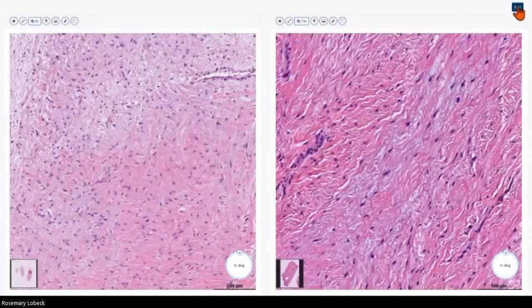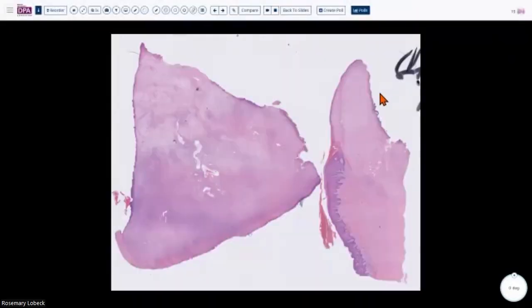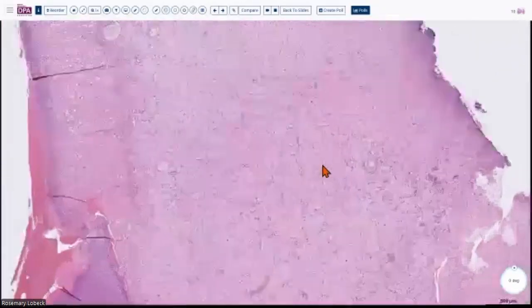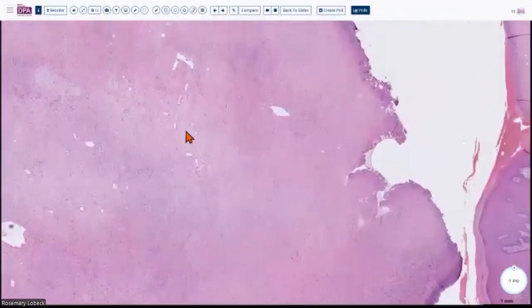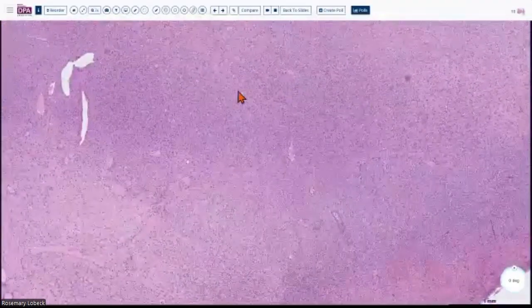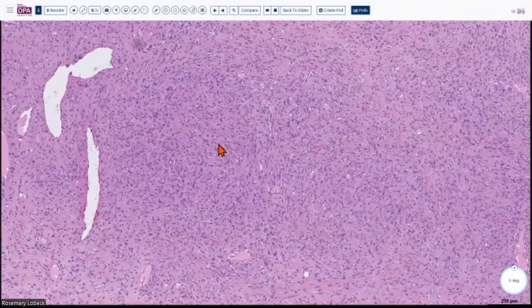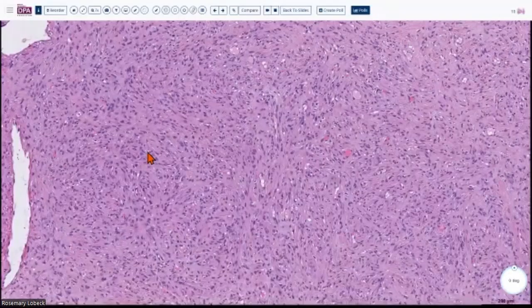So I will show you a little bit more of this later on, but right now I want to show you a couple of other things that low-grade fibromyxoid sarcoma can do, right? Same patient, we get this abdominal mass which was resected with this area which we now know is low-grade fibromyxoid sarcoma, but I want to show you the other section over here. So we get these low cellularity areas that we saw in the biopsy and also on the excision of this patient, but as you keep scrolling, you come across areas that are much more cellular. So low-grade fibromyxoid sarcomas can undergo dedifferentiation, right? So that's something that we've got to watch out for, and the cellularity can keep increasing, and it can even become pleomorphic at some point.